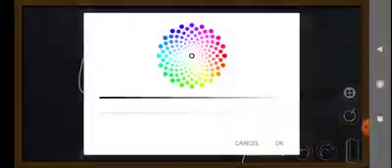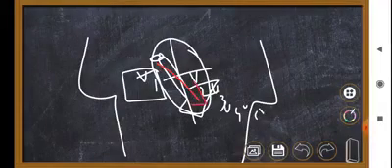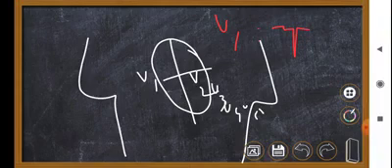So this current is moving away from lead V1. So in a normal person, lead V1 will show a negative QRS complex and a negative P wave as well. Just to simplify, in this video I'm focusing on the QRS complex and ignoring the other waves for the time being.